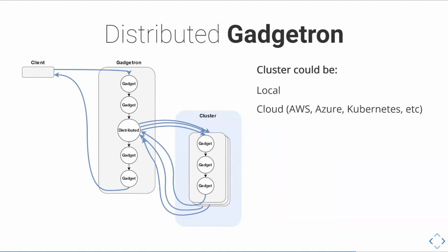It could be in the cloud, so that's actually the typical way it's being deployed clinically. But it could also just be like gather up all the laptops in your office and start Gadgetron on them. It doesn't really have to be all that fancy if you have an application that needs the extra computational power.